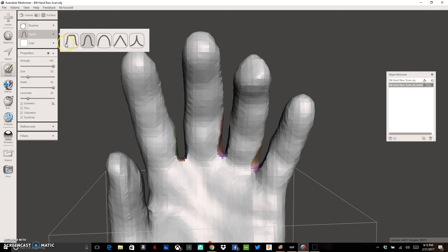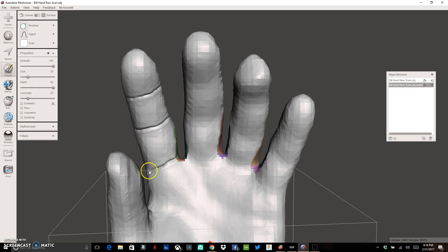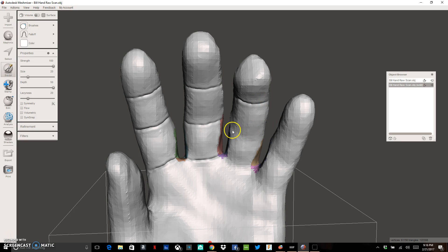With the Pinch brush I can actually make features inside of this model. The creases you have in your fingers — I can actually sculpt them in so they're permanent features. I do that by clicking and holding down the mouse button and dragging across from where I want the crease to start to where I want it to end, including down at the bottom of the finger. Your creases aren't going to be perfect — and you don't want perfect lines. If you look at the creases on your own fingers they're not perfectly straight, so you get a nice organic look. By doing this in Meshmixer rather than a traditional CAD program like Fusion 360, you can get more of a natural look. That does bring a little bit of artistry into this process.